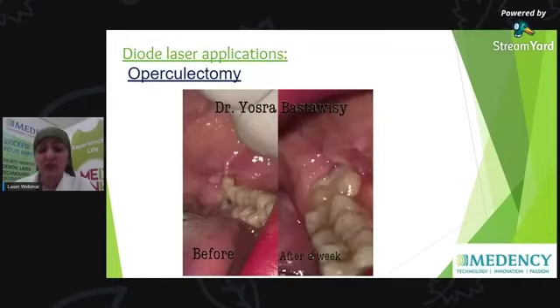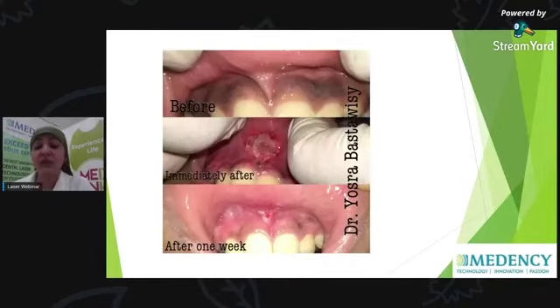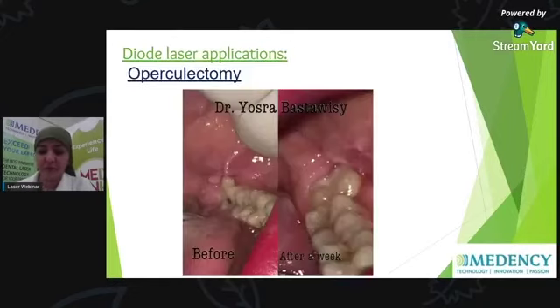Yeah, I forgot to tell you, in the phrenectomy, you should inject a little amount, a few drops of anesthesia injection, because this is one of the treatments where the patient is going to feel pain, but only a few drops, not a full injection of anesthesia.